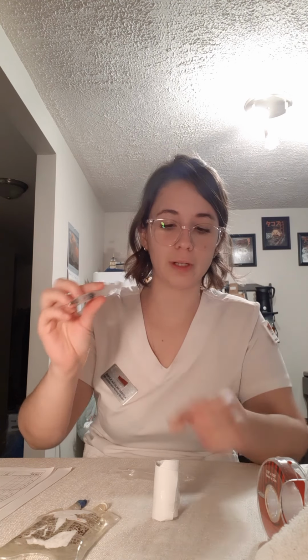And now I know that I need 50 milligrams, and I know that there is 50 milligrams in a milliliter, so I will draw 1 milliliter of the solution. Okay, so I'll be very careful. I'll draw 1 milliliter, a little bit over a milliliter, just to account for air and bubbles.